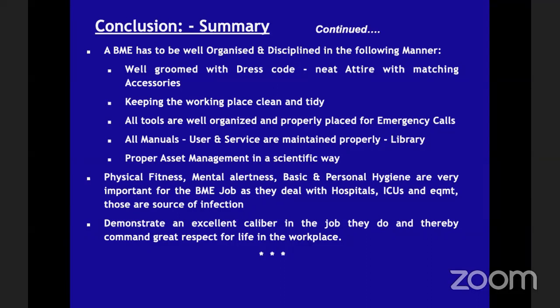There may be replications. There may be 4 spanners. There may be 4 different test equipment. Have them separately. The reason: you are getting a call from the ICU that the ventilator is not working. At the same time you are getting a call from the theater that the cautery is not working. And you are getting an emergency call from the emergency department saying that the defibrillator is not working. You are alone over there. Where will you run first? You should be educated on that.